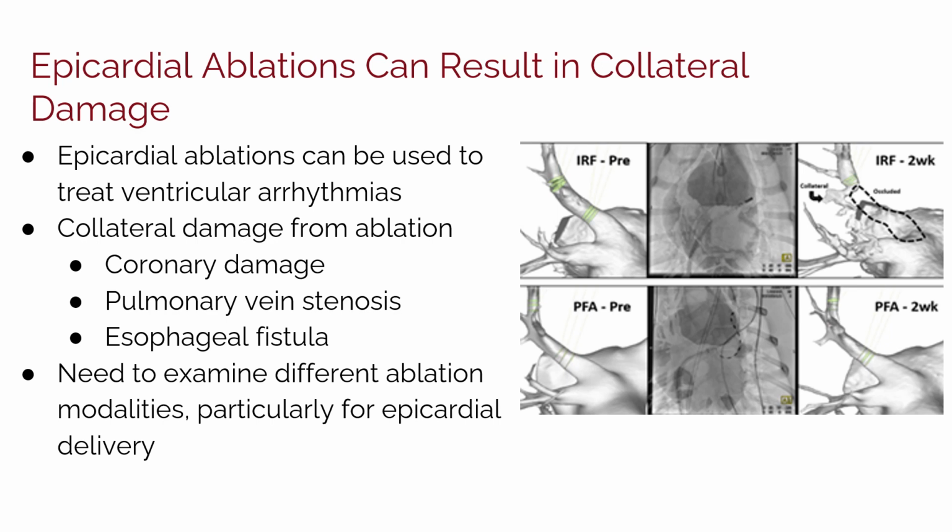A new ablation modality called irreversible electroporation is becoming more and more widely used in cardiac ablations. In the image to the right, you can see a 2 weeks study of irreversible electroporation compared to radiofrequency ablation. And in it, it shows that the radiofrequency ablation will cause pulmonary vein stenosis, whereas the irreversible electroporation does not.